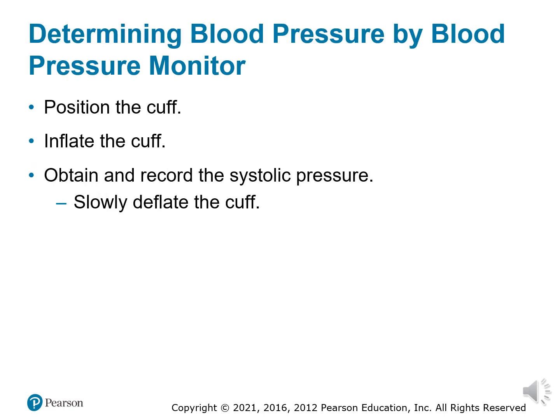Next, we're going to talk about determining blood pressure by blood pressure monitor. So you're going to position the cuff, inflate it, and then obtain and record the systolic pressure while you're slowly deflating that cuff.